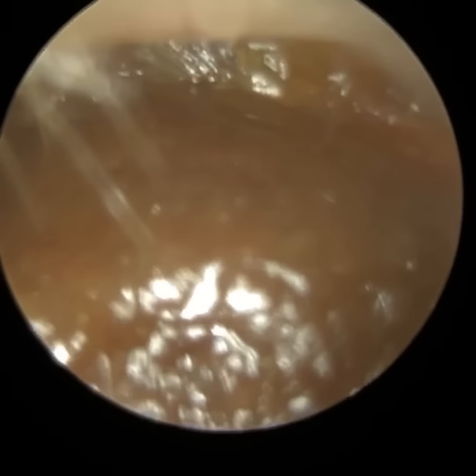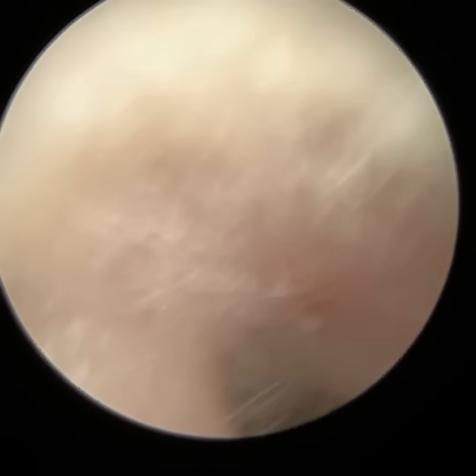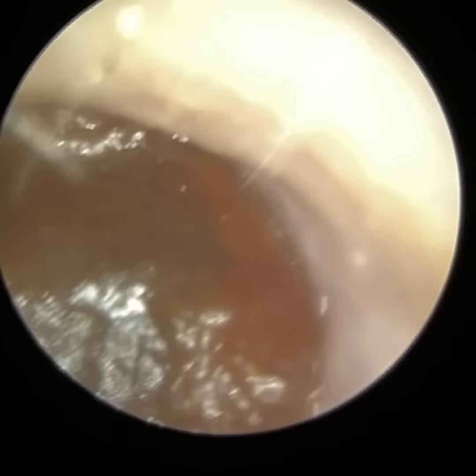Hi everyone, this is Neil Wright, consultant audiologist and director of Clearwax. Thank you for joining me in my latest video using the iClearScope Endoscope.